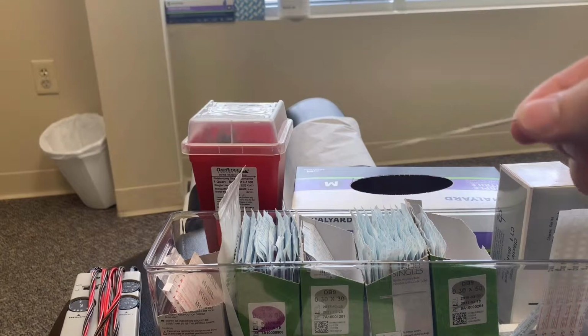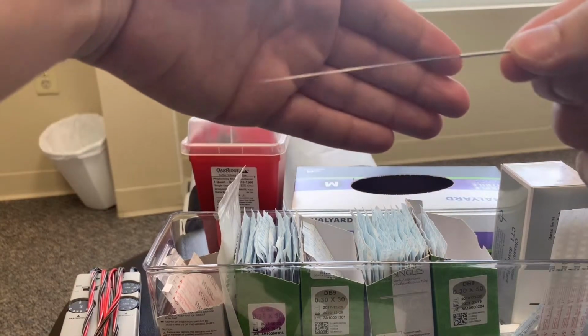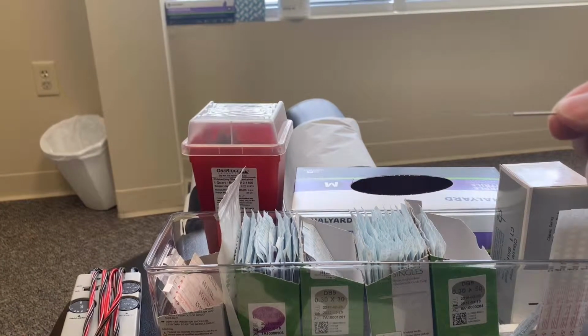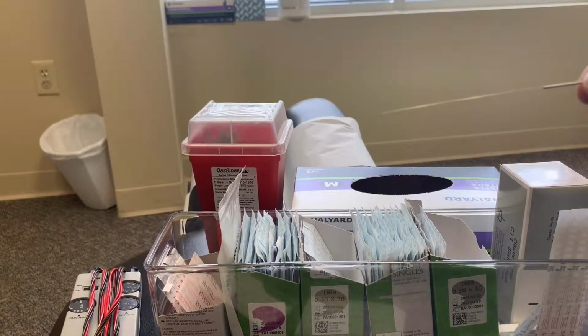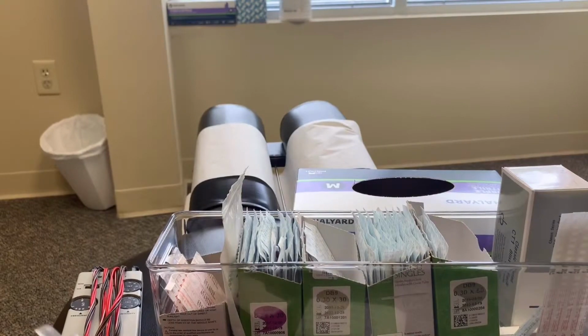So this is a pretty long needle. I'll put it behind my hand there just for reference. I typically only use this maybe in the butt where we have a lot to get through before we'll actually hit the muscle. Or maybe we're going down to a deep muscle like gluteus minimus. So this is a pretty long one. Let me just toss it in the sharps container here, and then I will show you one of the smaller ones that we use.